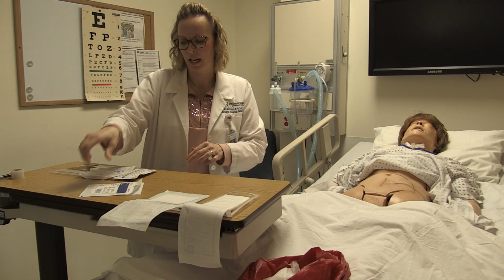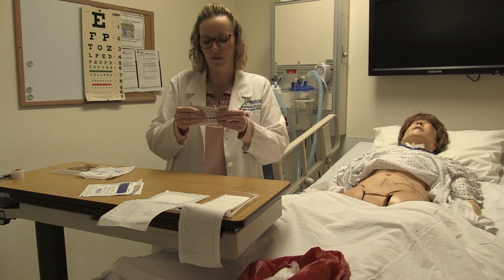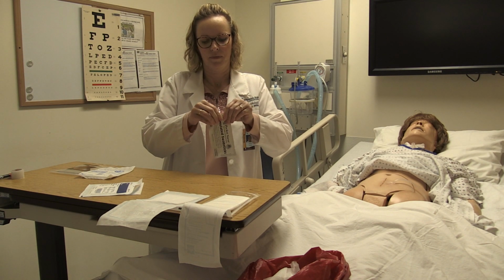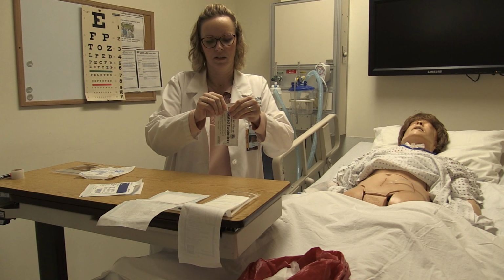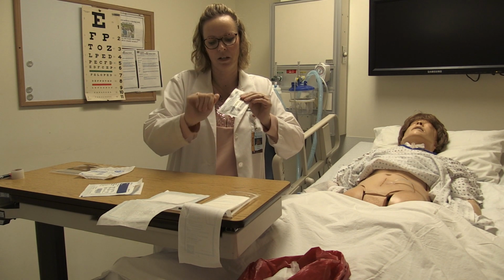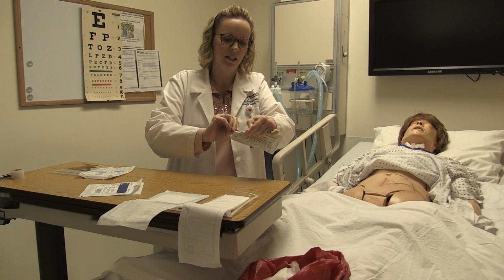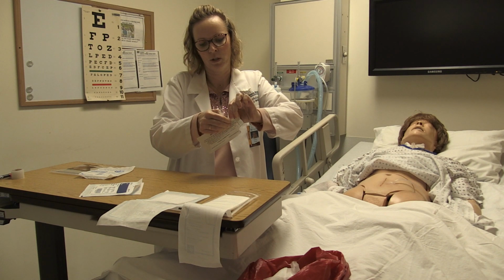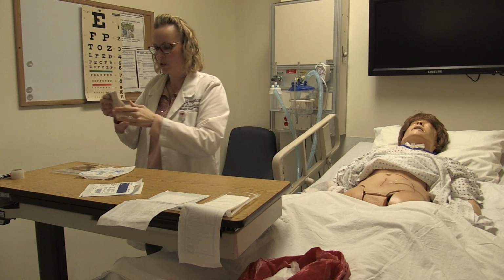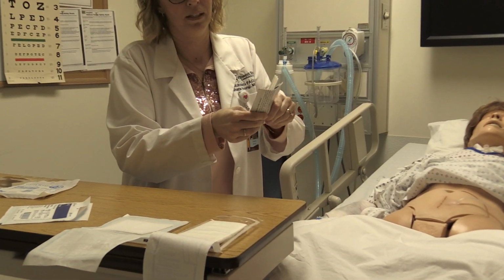The next thing I am going to open is my swab sticks. And it helps, you can feel in there, there's some sticks. And if you can push the swab sticks so that they're as close to the top as possible, so the sticks are closest to the top up here where you're going to tear it, it will help you in the long run, because you don't want to touch the stick part because that's sterile. And I'm going to show you a trick on how to get those out when you have your sterile gloves on. But the key is to make sure that you have them easily accessible. So you want them to stick out a little bit here.